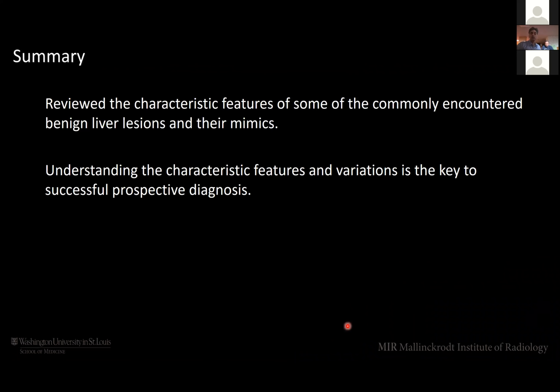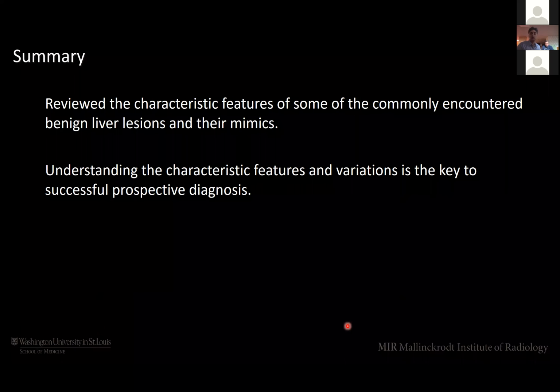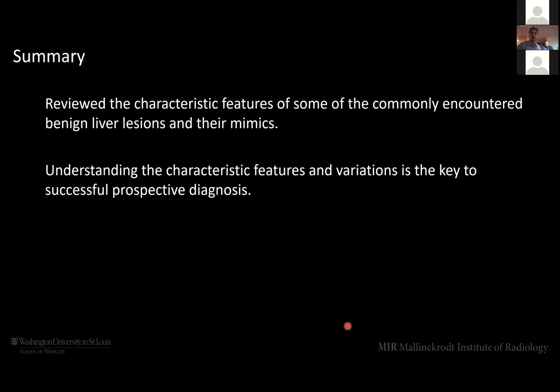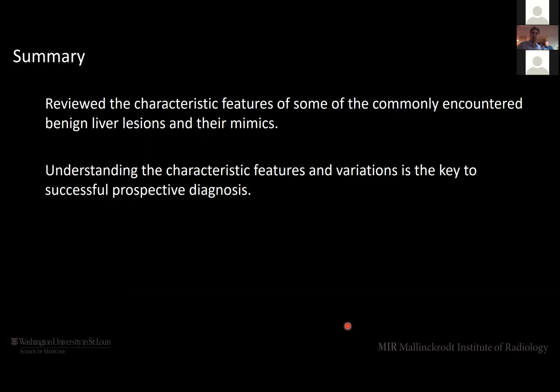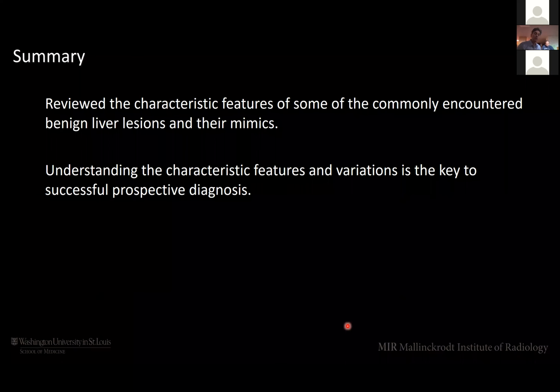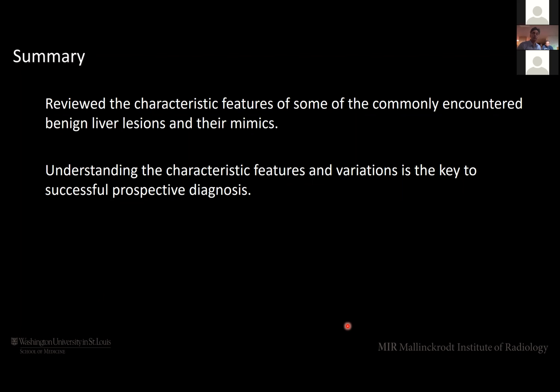So I know this is a mix of cases I kind of took you through. We did not cover hepatic adenomas or hepatocellular carcinomas, which are a topic of discussion by themselves, and have reviewed the characteristic features of some of the commonly encountered benign liver lesions and their mimics and the malignant counterparts. We looked at those. As I mentioned earlier on, understanding the characteristic features and variations is the key for a successful prospective diagnosis of the lesions.